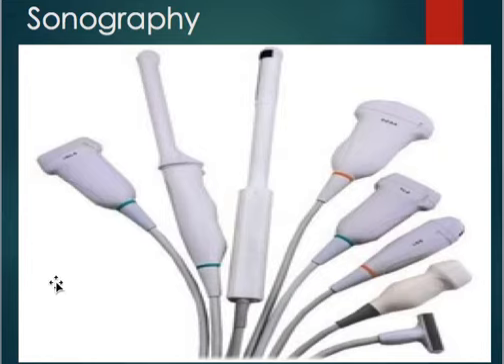Usually that's fluid. Remember, on x-rays, black was air, but on ultrasound, black is fluid. So a lot of times it could be a cyst or a tumor. Those things are going to be dark on the image.